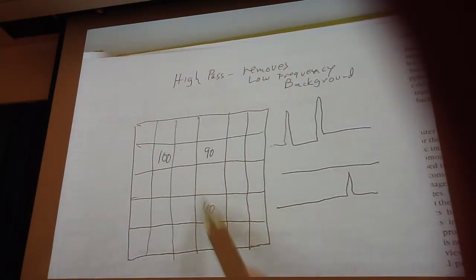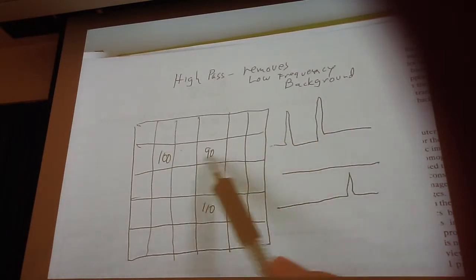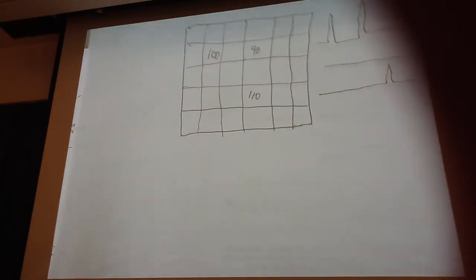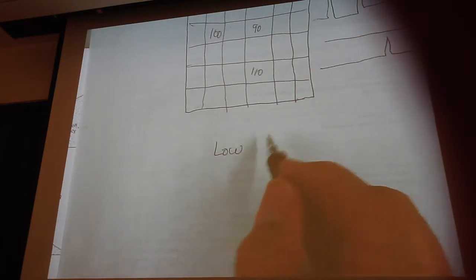These images would be grainy because you have lots of gaps between pixels, so there's a lot of information that's missing. So to make it look a little bit better like this, the low-pass filter does a process called smoothing.